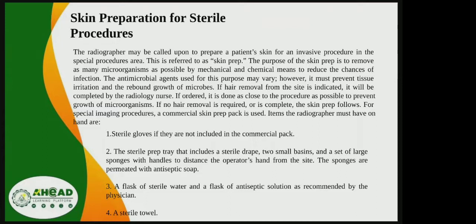The antimicrobial agent used for this purpose may vary. However, it must prevent tissue irritation and the rebound growth of microbes. If hair removal from the site is indicated, it will be completed by the radiology nurse. If ordered, it is done as close to the procedure as possible to prevent growth of microorganisms. If no hair removal is required or is complete, the skin prep follows.